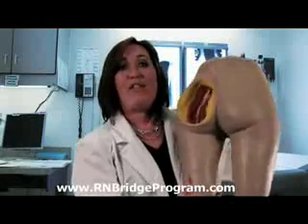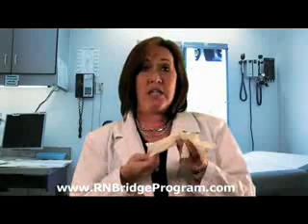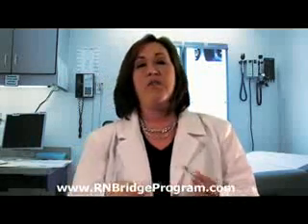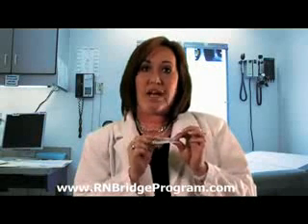Now let's talk about some of the supplies that you're going to need when you're getting ready for this procedure. You need a pair of non-sterile gloves. We're not doing a sterile procedure, so non-sterile is absolutely fine. You also need your syringe with your medication, and then you need a 1.5 inch long needle.